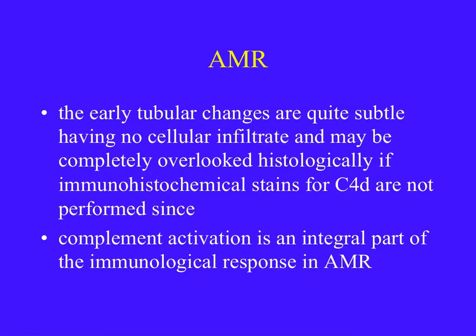Because the early tubular changes can be quite subtle, having no cellular infiltrate, they may be completely overlooked histologically, and this is the reason why we introduced immunohistochemical stains for C4D in our everyday routine practice. We know that complement activation is an integral part of the immunological response in AMR.